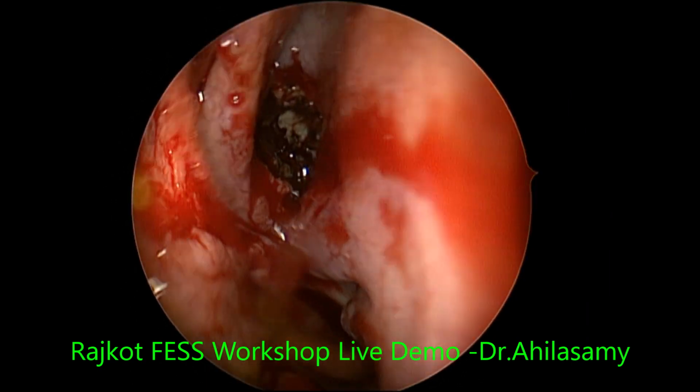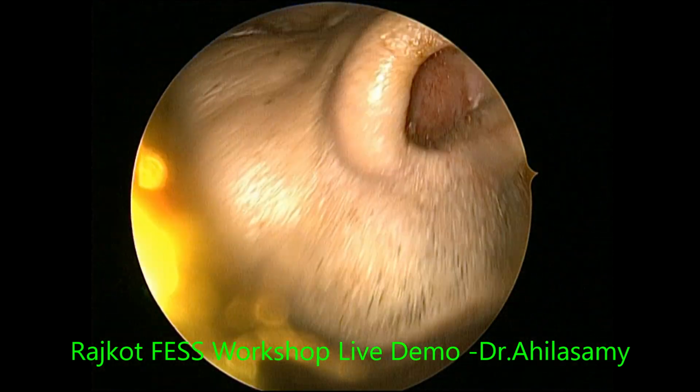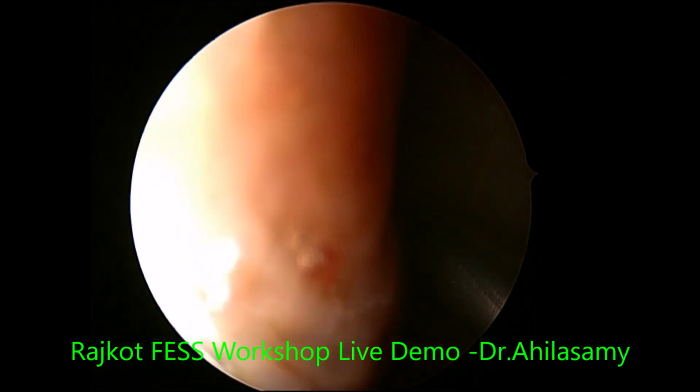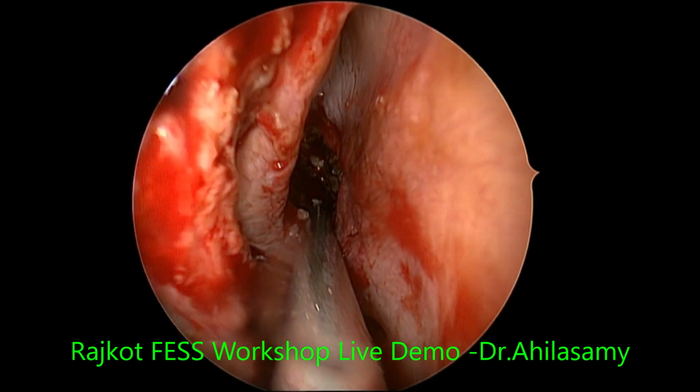Okay, a little more you have taken, some more I will take. That's the technique, these are all secrets. But everything will be in my YouTube videos. No hidden things, all for teaching instant.